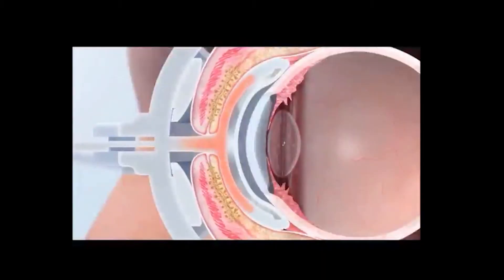The basis of the LipiFlow procedure is heat — it's more or less a controlled warm compress, controlled in terms of temperature and duration. LipiFlow incorporates the use of what we call an activator, which is like a protective scleral contact lens that protects the front of the eye and heats the lids from the inside out. As opposed to a warm compress which heats from the outside in, we heat from the inside of the lid out. The controlled temperature heats to 42.5 degrees, and the activator has little fingers on it that massage or pulsate against the front of the lid.